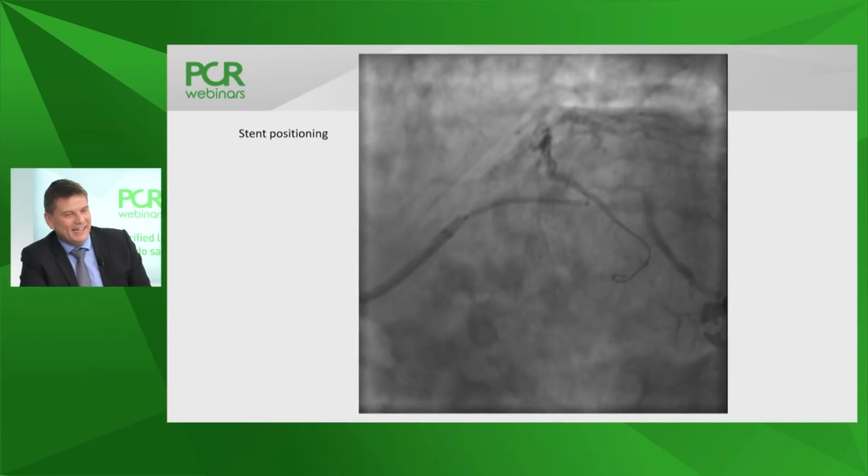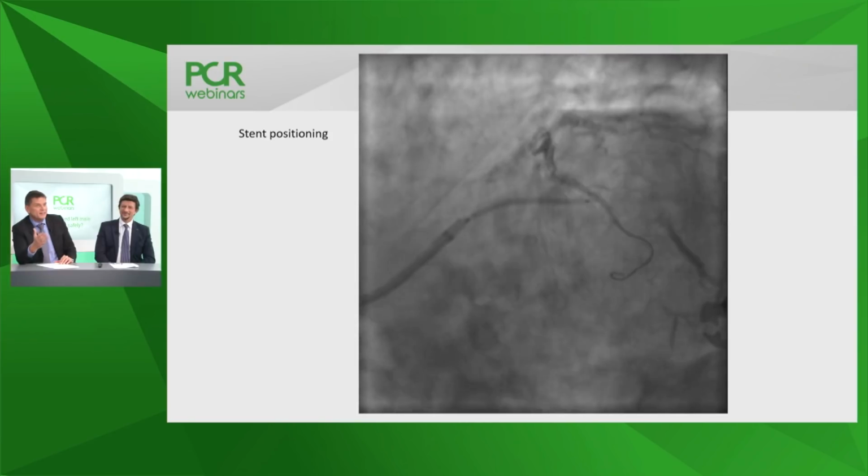Let me hear what Chris thinks about it. What would be your size? Honestly, Flavio, I disagree on this point. I think I would choose according to the circumflex, which would be then the distality.